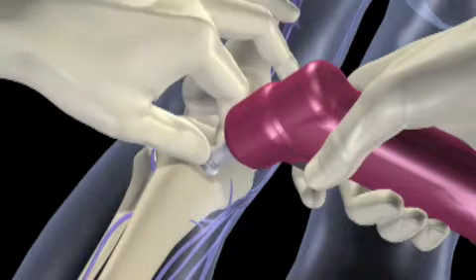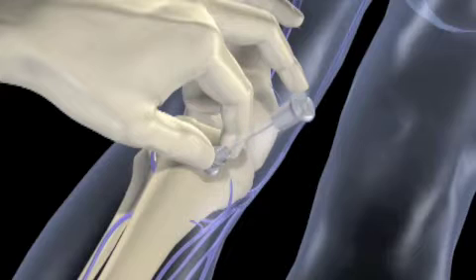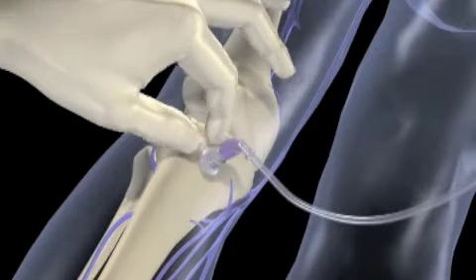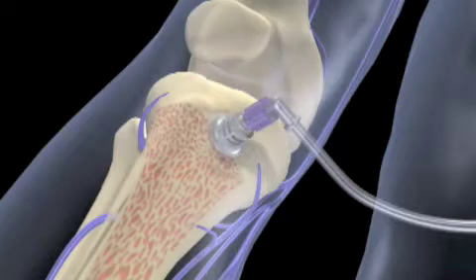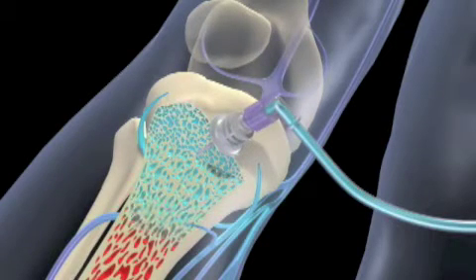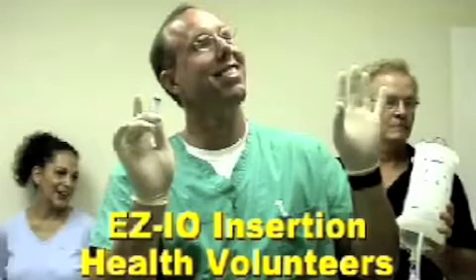You're going to see them holding on there, and then the drill just pops off the bit. It's just held in there with a magnet. Then the stylet unscrews just like it does with the pediatric IO. Hook it up to the extension set. We're going to get a little 3D zoom in here, and you'll see the flow. It goes in through a 15 gauge catheter, but it flows a little bit slowly, like a 22 or a 24 gauge, I've found. And then it gets right into the system, and that's that non-collapsible vein that we're talking about. Now let's take a look at this on some real volunteers.